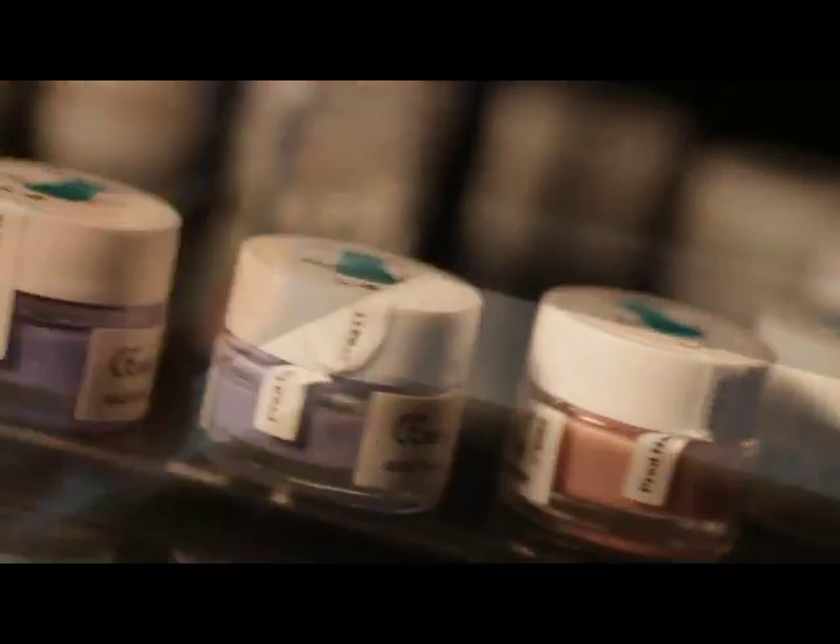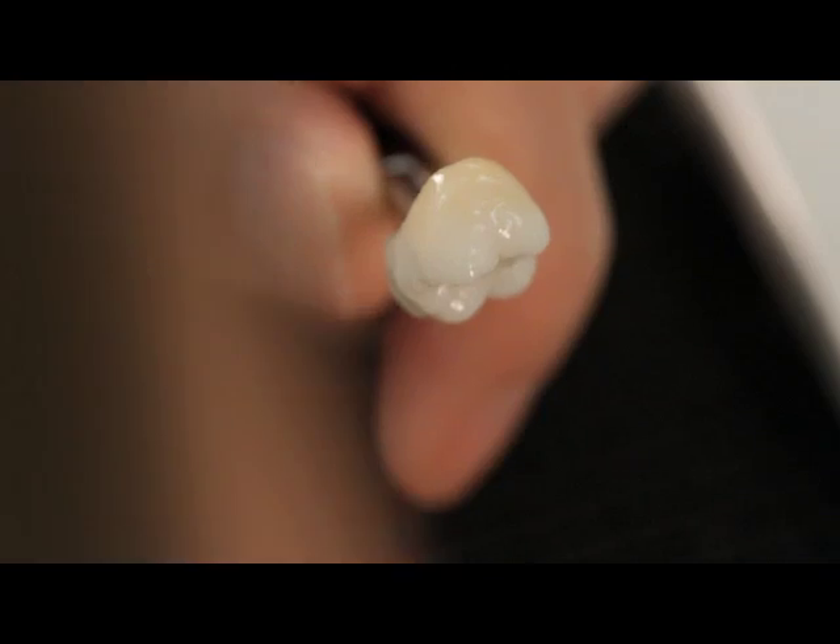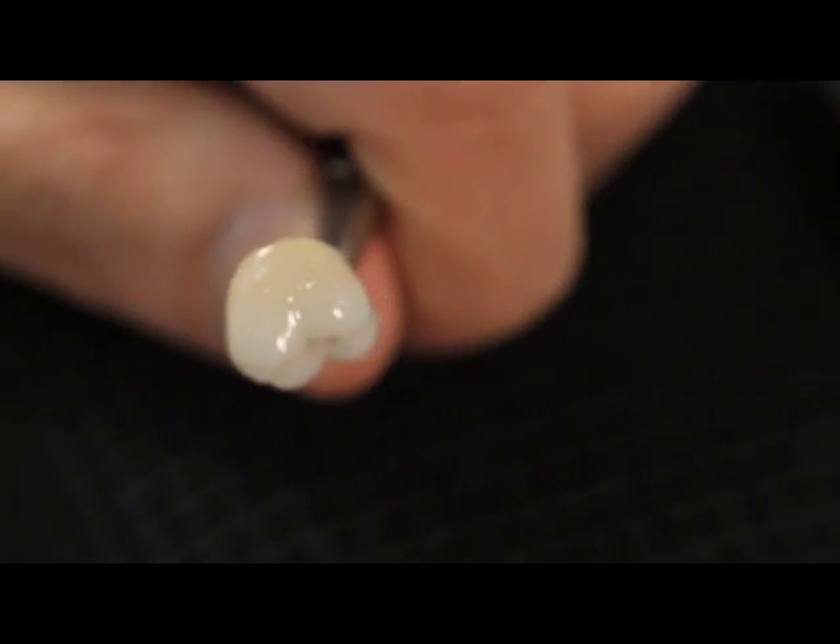These Lustre Paste NF represent a modern alternative for conventional staining and glazing, as well as for the color, brightness, gray value, and surface texture corrections of all your ceramic crowns and bridges.